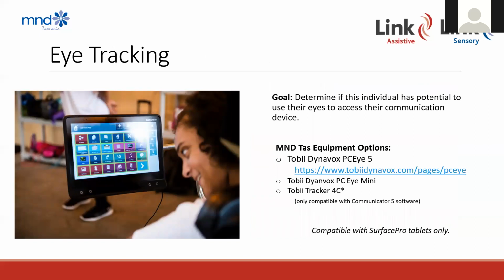Your next option to consider is eye gaze and eye tracking technology. This is the technology that's most commonly associated with, or thought about when we're thinking of, the population of people with motor neuron disease, because for best eye gaze access, what we want is somebody to keep their body completely still and just isolate accurate movement of their eyes.